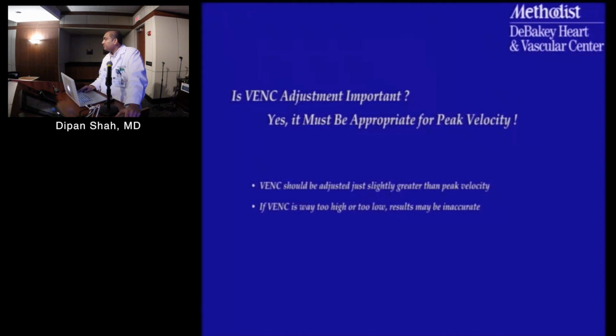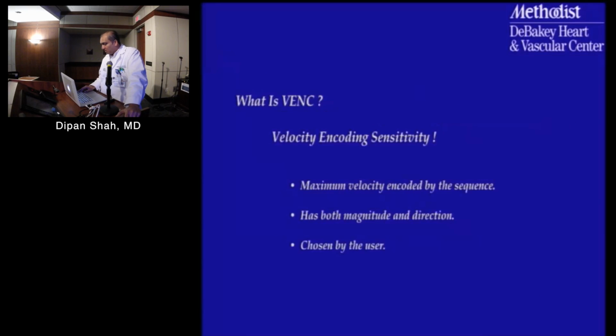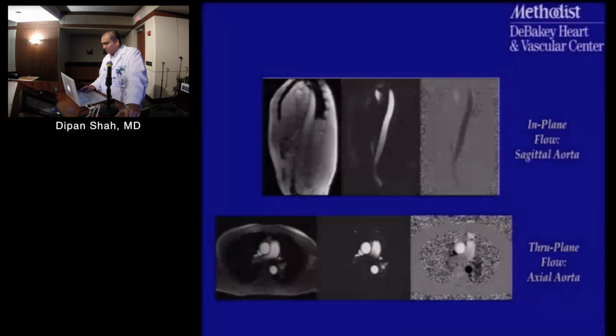Okay. About the calibration that you have to do before every test regarding flows. Where does that fit? Yeah, I don't know. If you're going to talk about it.